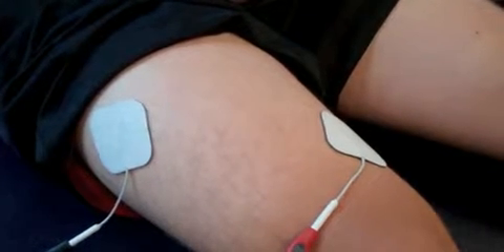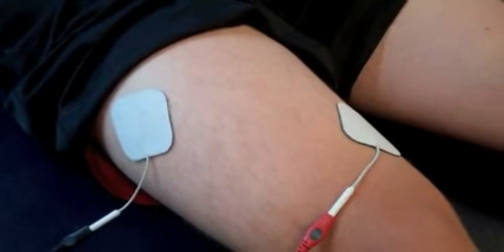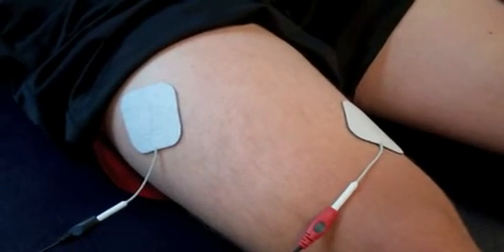We run it for a certain number of reps or until the prescribed time is finished, and then the machine will shut off.